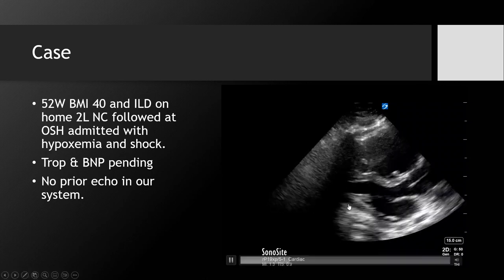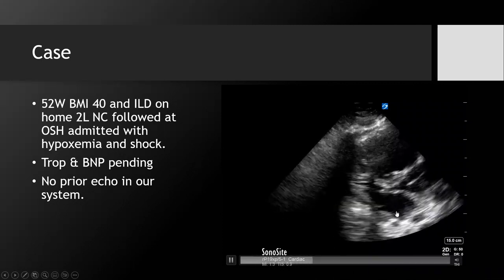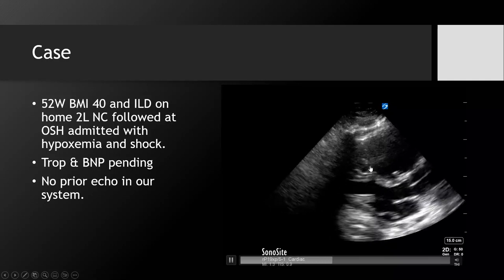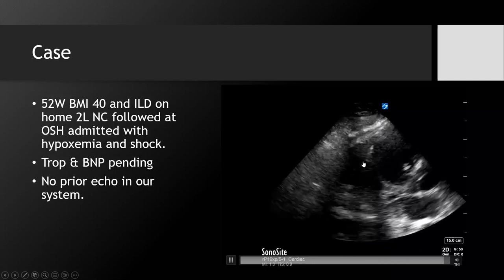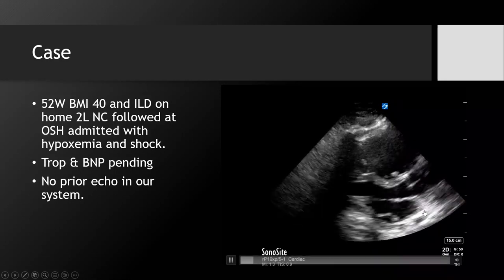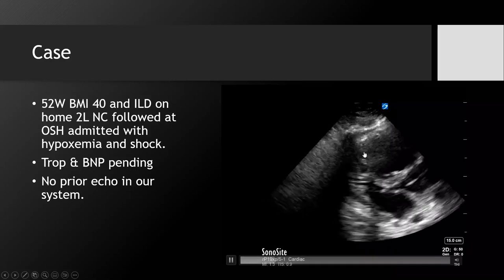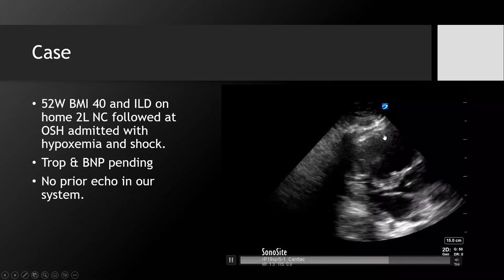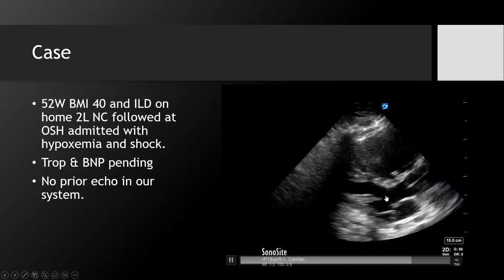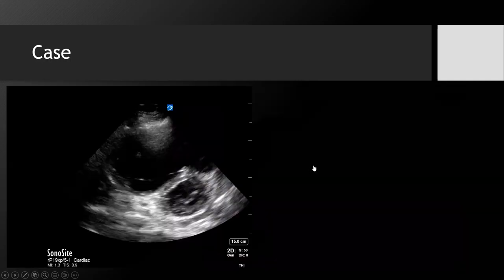We're not live, so I'll have to just walk us all through it, but we're in the parasternal long axis view, and this is what I call the RV takeover view, an RV takeover sign, where the RV is playing the primary role, stealing the show in this view. You're on axis, you have the LA, mitral valve, LV, aortic valve, aortic outflow, but the RV is significantly present. And you might even be able to appreciate that some of that septum is bowing into the LV. So you can expect a pretty prominent D sign when you're looking at the parasternal short axis.